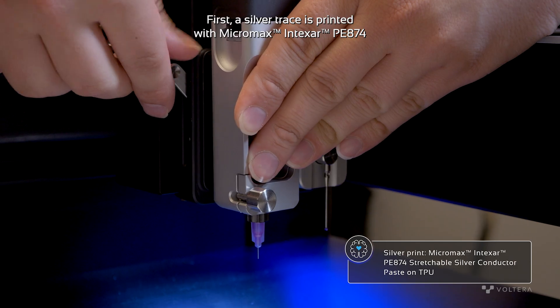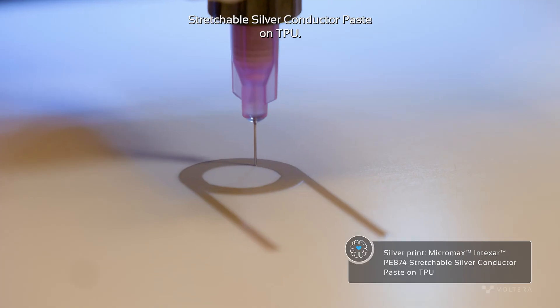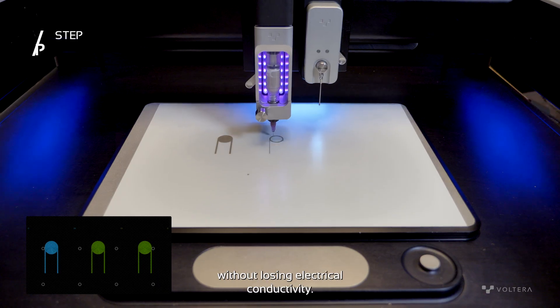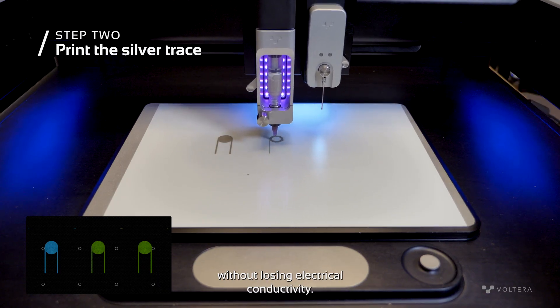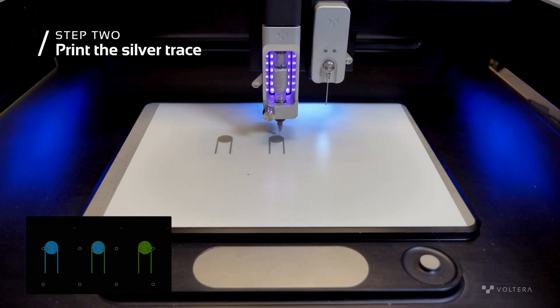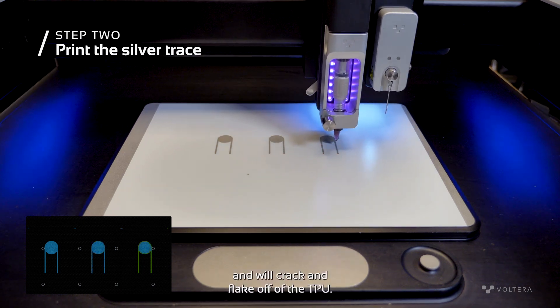The second print is done on NOVA. First, a silver trace is printed with Micromax Intexar PE874 stretchable silver conductor paste on TPU. This silver ink can bend up to 180 degrees without losing electrical conductivity. We use silver ink for this step because gold ink is not stretchable and will crack and flake off of the TPU.